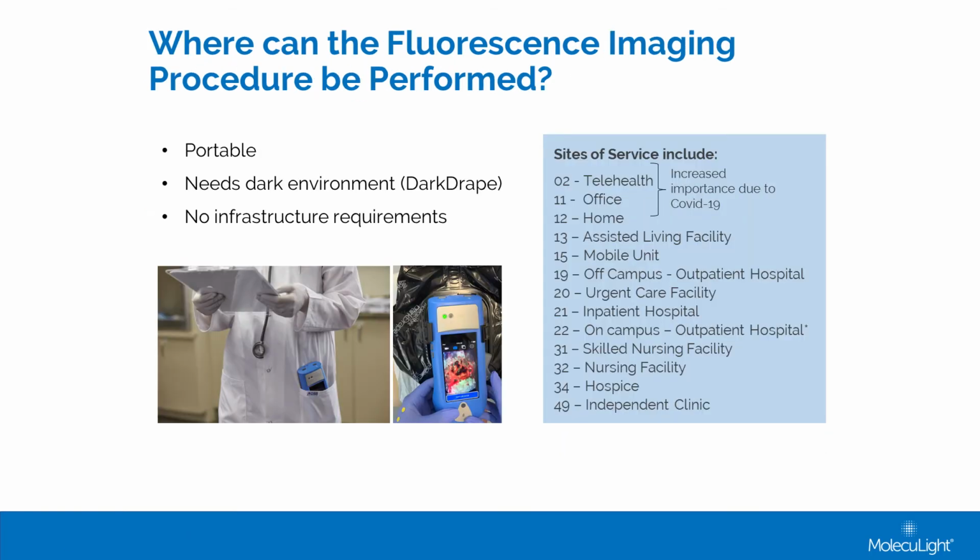This can be used anywhere. It's portable. It does need a dark environment, which you can also use dark drape if necessary if you're in a room, say a patient room that has a window that can't be darkened out, and it requires no infrastructure. This isn't tied to the radiology department or the laboratory department.